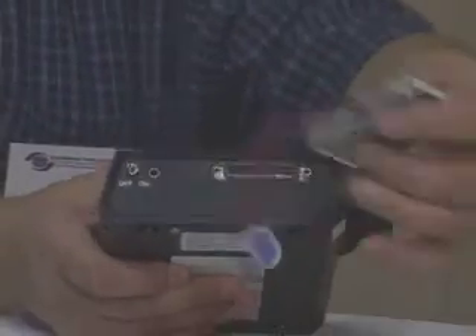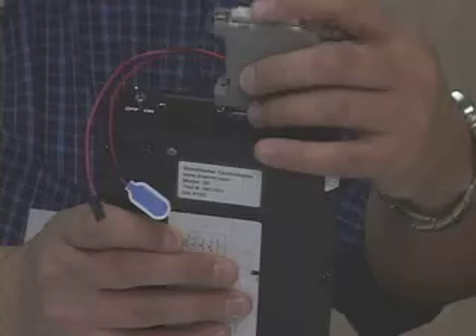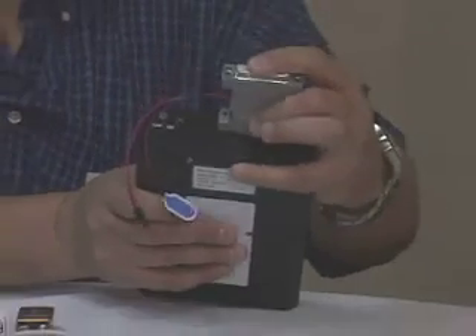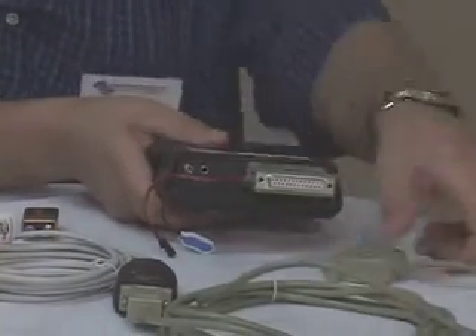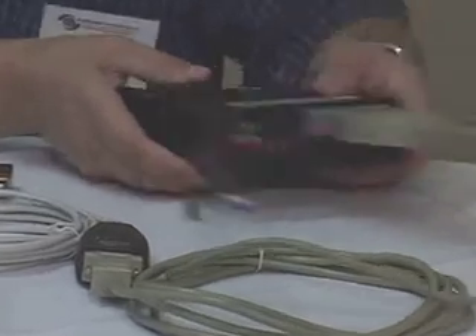The rescue kit itself goes in line with that cable. So we're going to take and plug the rescue kit in. As that goes in, we then simply attach the serial cable to the other side.